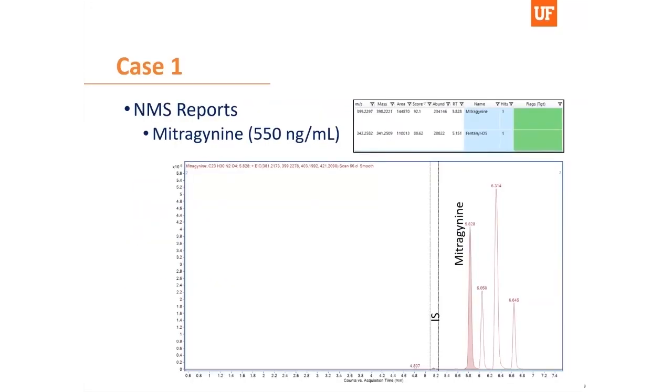Although we could see this compound through our base screening techniques due to its great abundance, I wanted to include this to show the chromatography that we observe when we have mitragynine positive cases. For mitragynine positive cases, there are usually several peaks that elute after the mitragynine peak. These are most likely due to the other alkaloids associated with mitragynine.